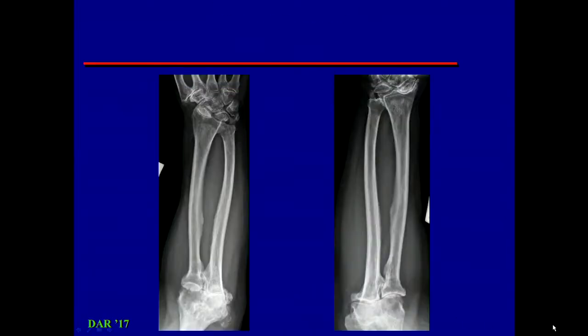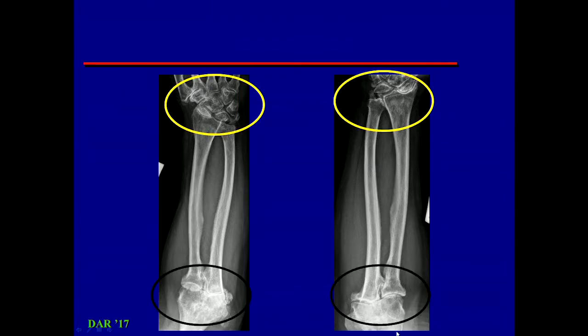And then finally, we have a patient like this who has osteoarthritis, an unusual distribution, multiple joints. Now we would say that there's probably some syndrome going on that's weakened the cartilage all over the body.